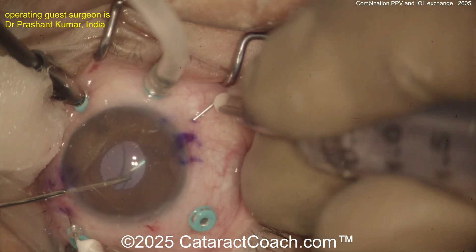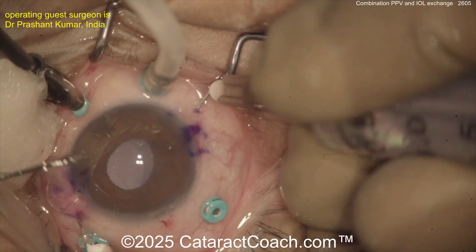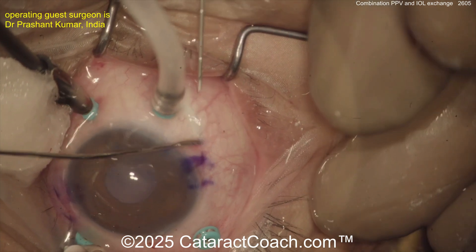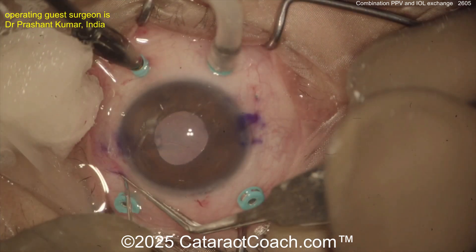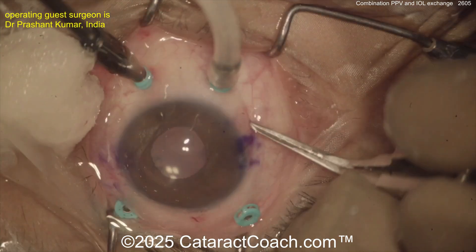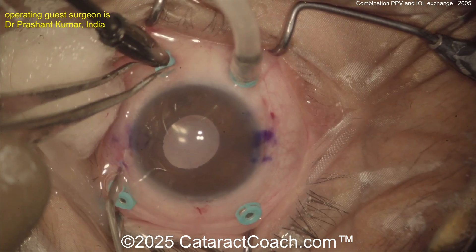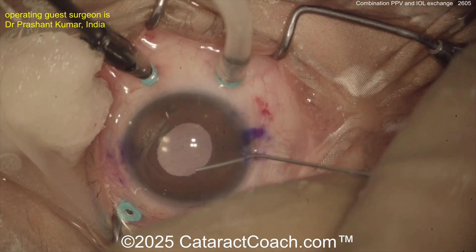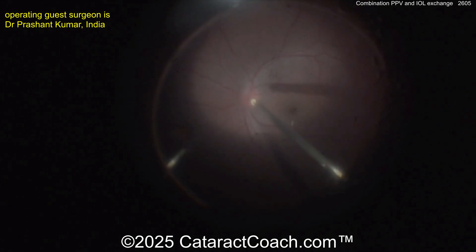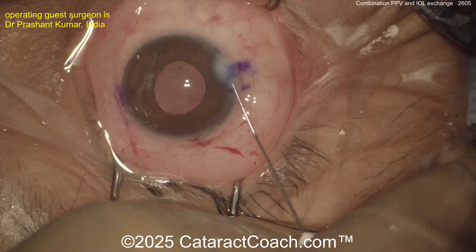Getting the haptic outside the eye — my most important pearl: once you get it outside, make sure those flanges are not just sitting under the conjunctiva. Make sure they're embedded within the sclera. Any residual flange in the subconjunctival space will erode and put the patient at risk for endophthalmitis later on. My final pearl: share the love and the liability with the retina surgeon. I like to send the patient to the retina surgeon, tell them what IOL power I want to make sure the patient ends up myopic, and then three months later I can do LASIK or PRK to nail the refractive outcome. One colleague showed a series where he put in a light adjustable lens — scleral fixated — which is another interesting approach for a good post-operative target. At the end, just a little more cleanup in the vitreous cavity and clearing any residual viscoelastic to help prevent post-operative IOP spikes.